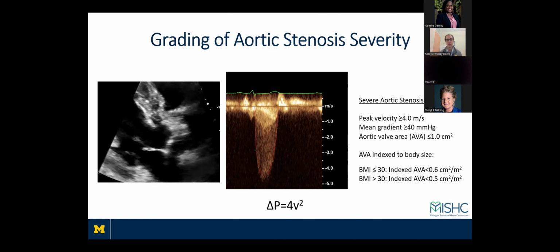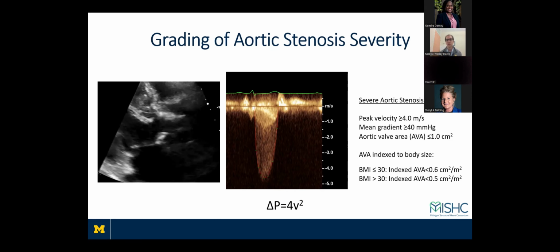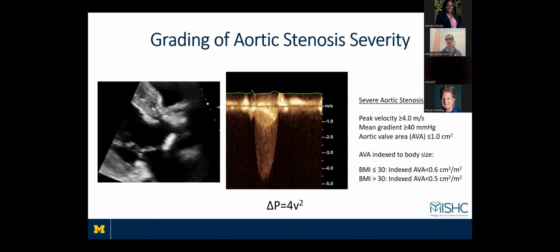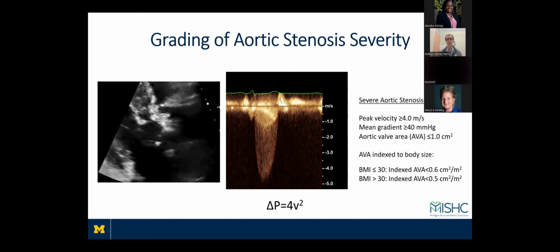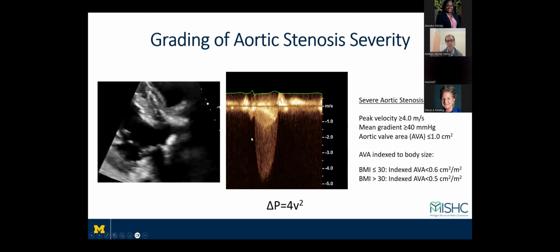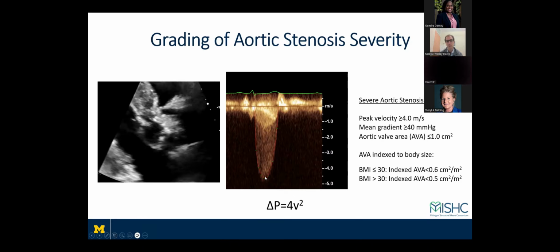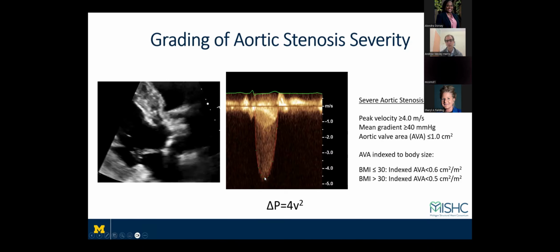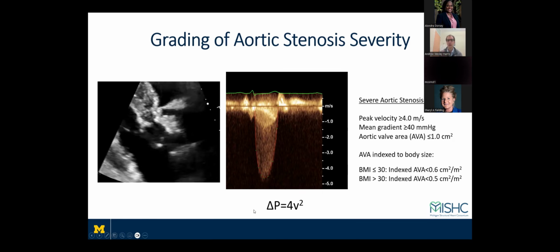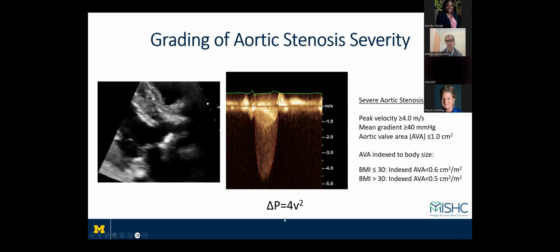And so the sonographers are trying to line up the Doppler with the aortic stenosis jet as much as possible to really try to show the maximal speed of blood flow as it accelerates through the stenotic aortic valve. And as you can see, for this patient he had a peak velocity of about 4.5 meters per second on this aortic stenosis jet.